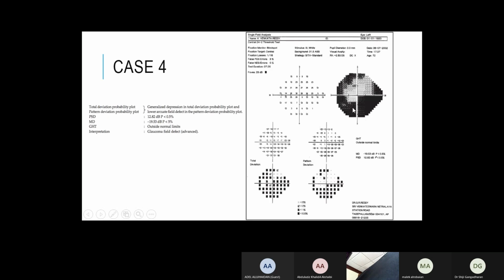So in this case, we said we can classify the severity in mean deviation, and what else? There's something else we can indicate the severity of the disease. Yes, central or paracentral or reaching center. What do you think here? It's reaching center or not? Yeah, so when we see this, it's called split fixation. It's reaching the center. What do you want to do next?